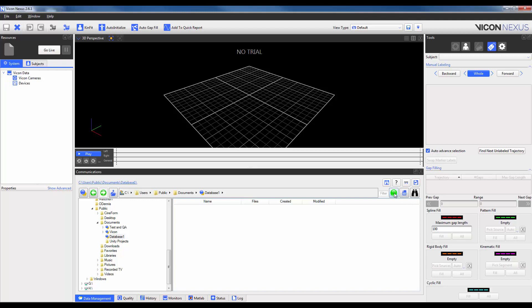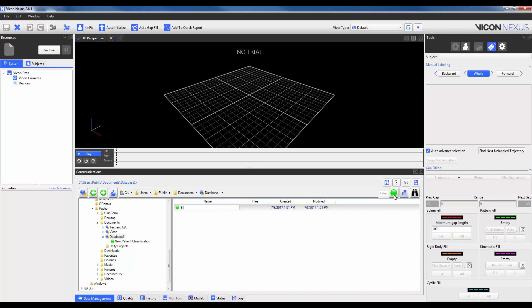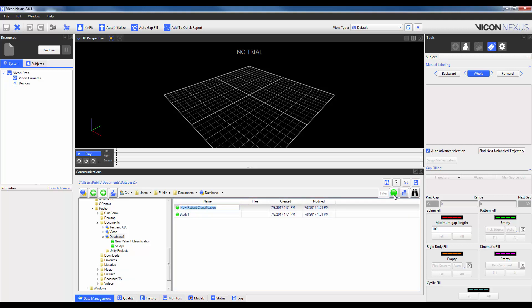This involves creating a new patient classification by clicking on this green button over here. You can think of a patient classification as a study. So I'm going to go ahead and put in a study name. As long as I'm in this level, I can go ahead and create as many studies as I would like.